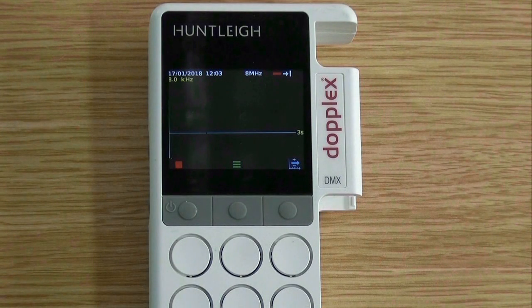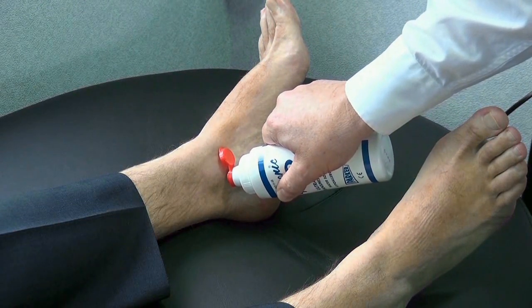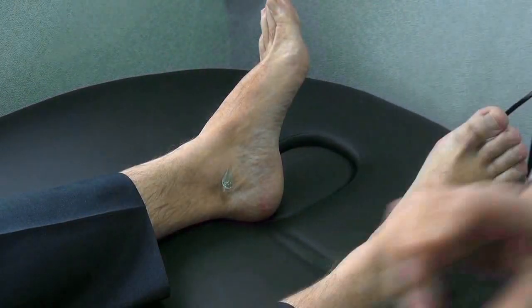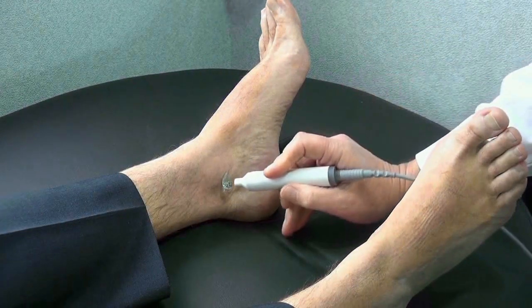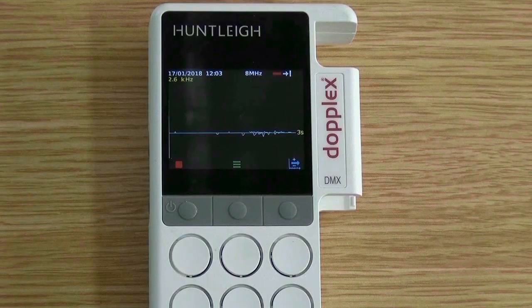With the Doppler unit turned on, place some gel over the vessel of interest. Then place the probe at 45 degrees to the skin and move it slowly across the vessel trying to get the loudest possible sound. You will now be able to see the waveform being produced from the Doppler sounds.